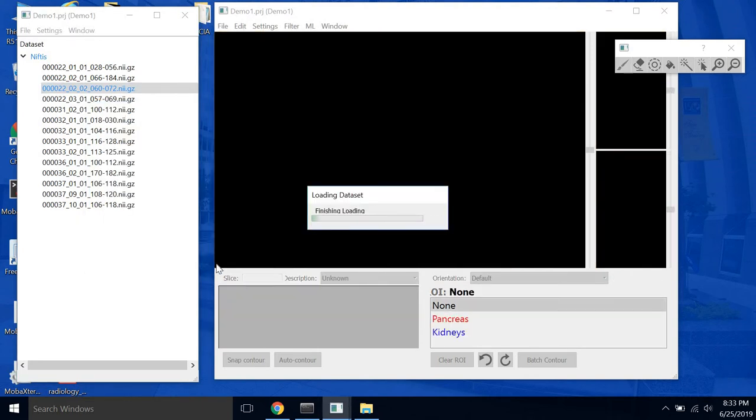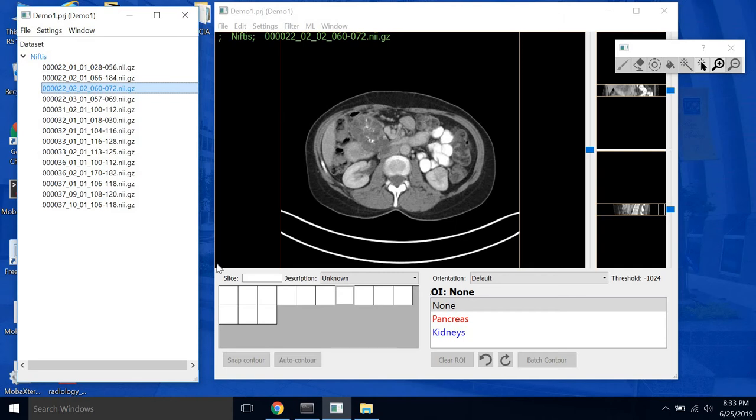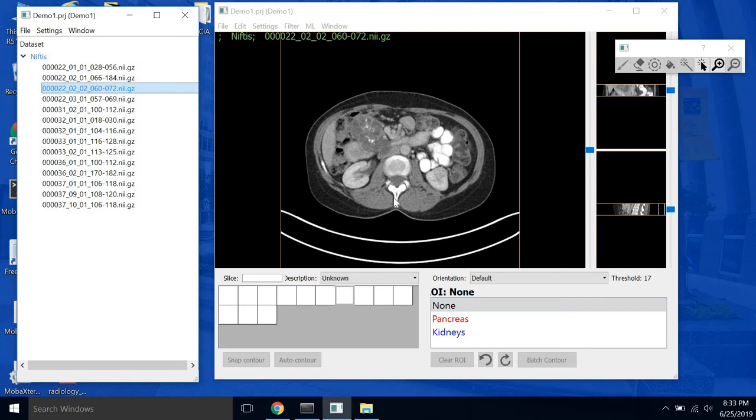When you're done click OK. Your project will reload. And now you notice in our ROI editing pane down here we have two new ROIs, the pancreas and kidneys. So that's how to create an ROI.